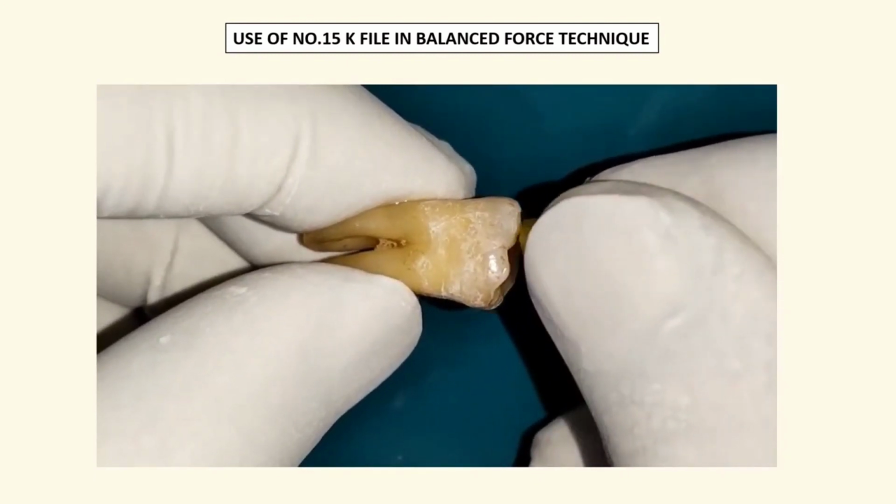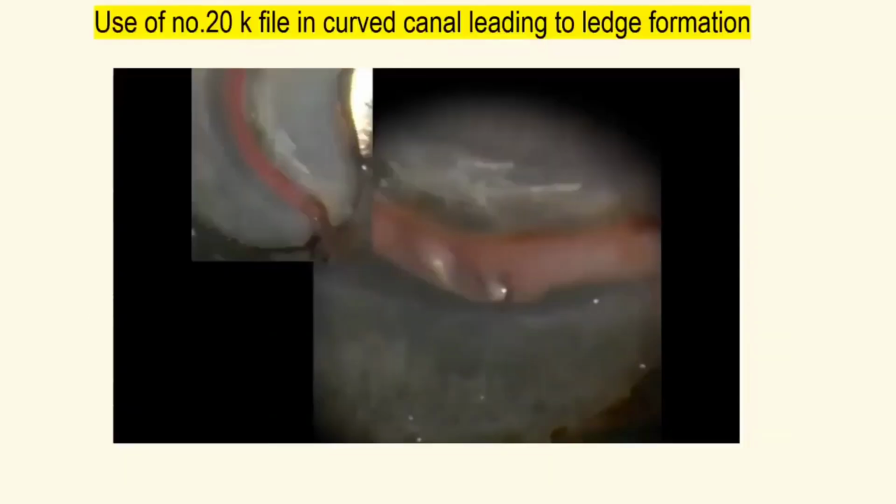90° clockwise, 270° anti-clockwise. 90° clockwise, 270° anti-clockwise, and at the end a 360° full clockwise turn and remove the file. This is the balance force technique.